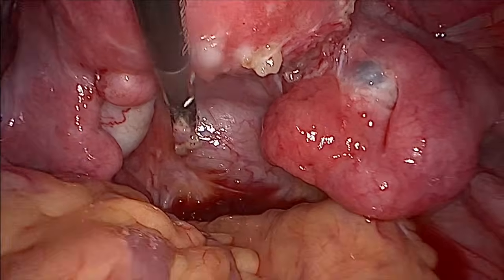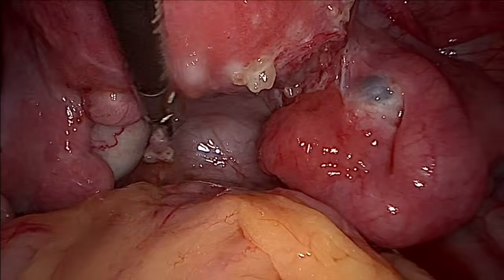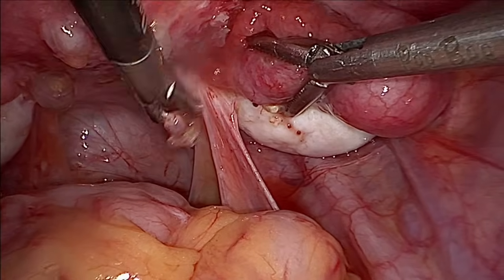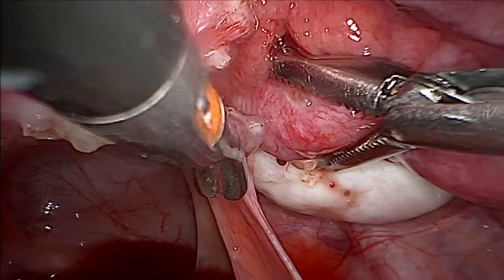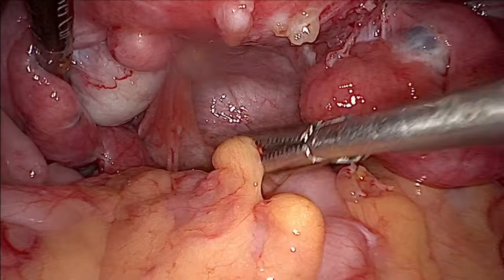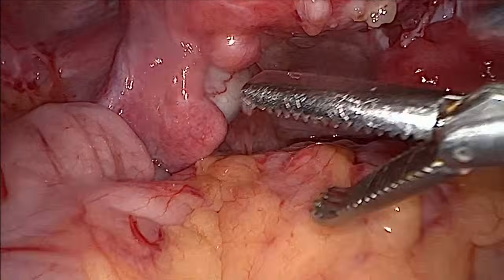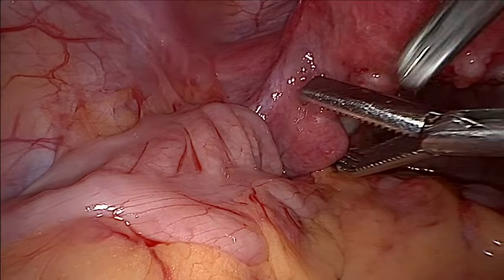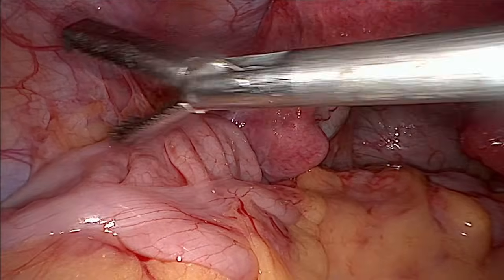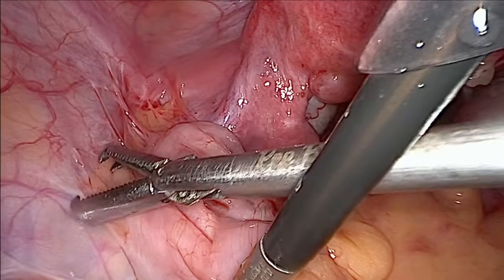You can see the POD is free, but there are some little adhesions here at the uterosacral ligament on both sides. You can see this nodule here. The peritoneum is kinked here on the right side and also on the left side. Now we will come back a bit. You can see the sigmoid is going here and it is adherent here. We all know the first step: we will start from sigmoid mobilization.